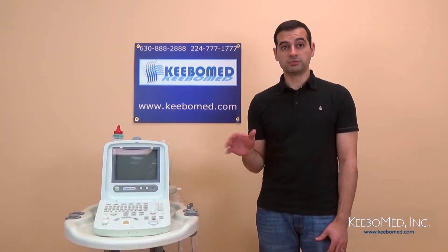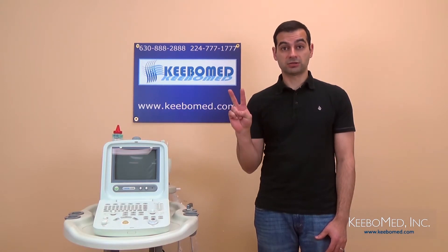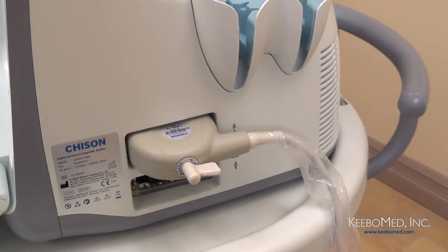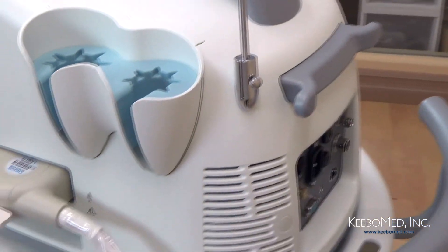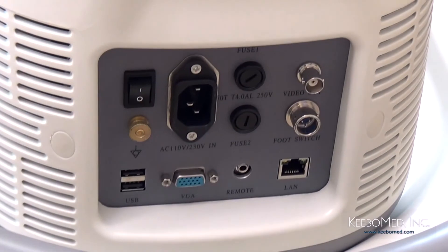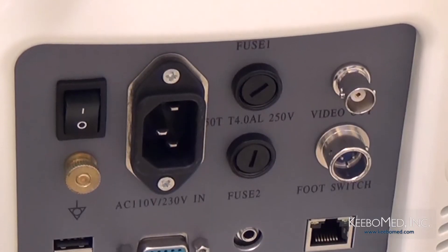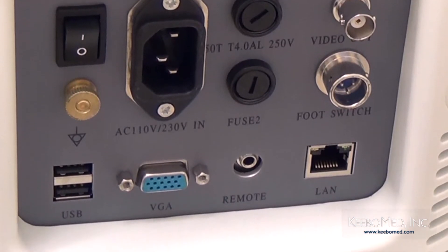The 8300 features many ports that allow for greater functionality. Two probe connectors are standard, which allows for more versatility to have two different probes connected to the machine at once. It has two USB ports, which is perfect for various uses including a USB storage drive. Other ports include a VGA port, a video port, a LAN port, a remote port, and a foot switch port.